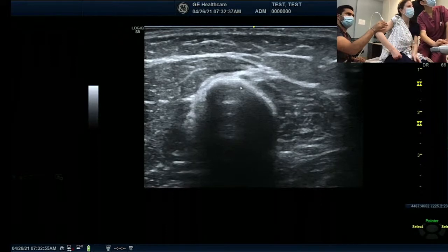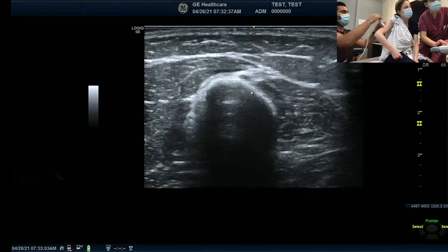Yeah. So here, this is going to be medial head and lateral head. You can see the dividing of these two muscles, right? And the radial nerve is on top of the bone, on the spiral groove. It's very clearly between the medial and lateral head of the triceps.